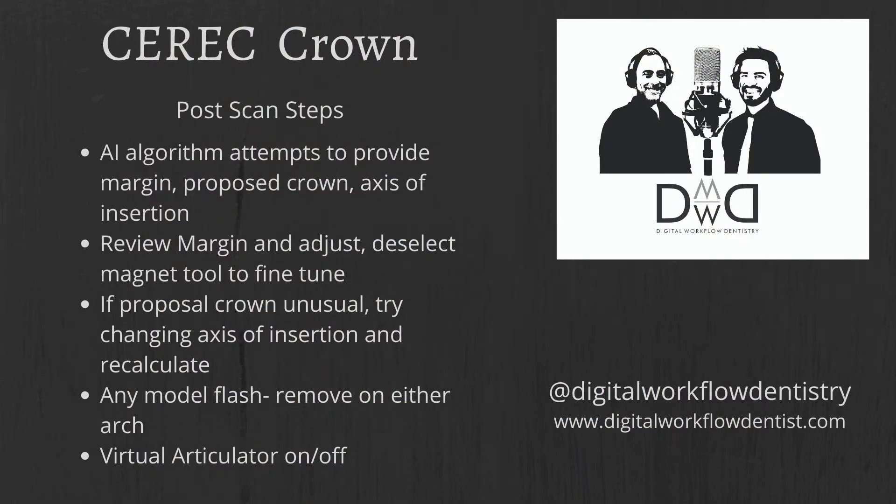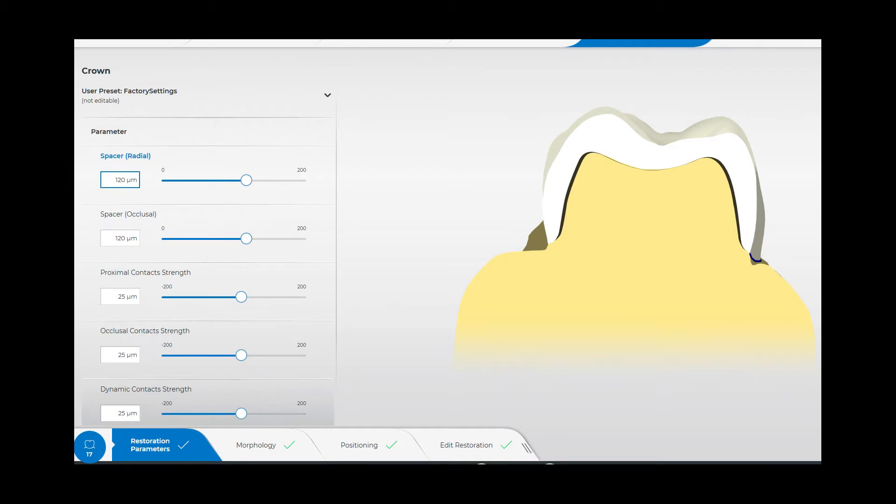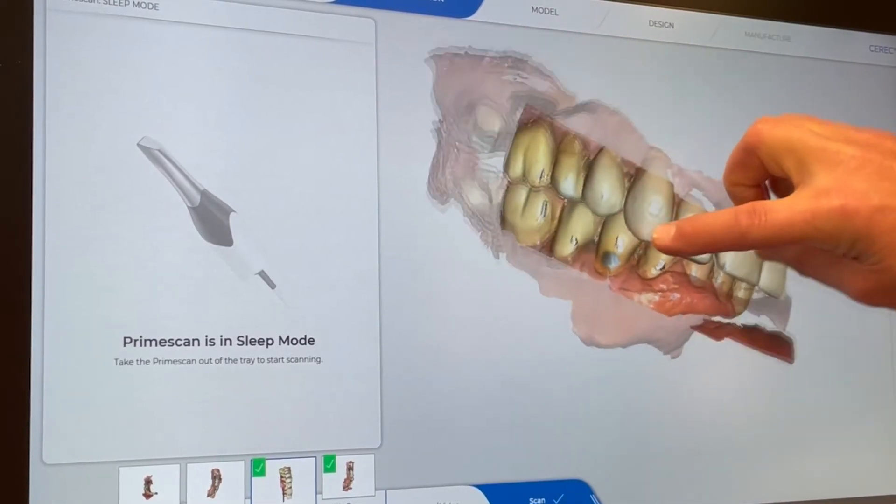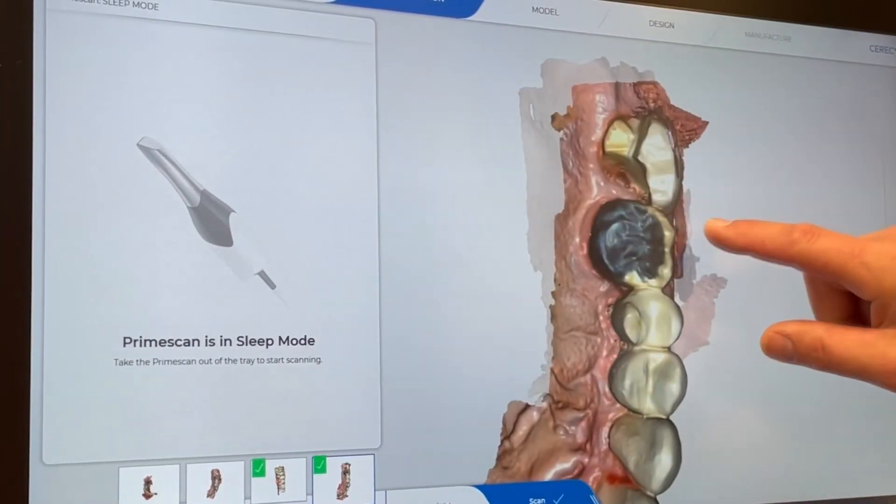Now let's talk about some of the post-scan steps. The AI algorithm attempts to provide a margin, proposed crown, and axis of insertion. Review the margin and adjust. Deselect the magnet tool to fine-tune, and if the proposed crown is unusual, try changing the axis of insertion and recalculate. It's also important to remove any model flash. Here are some of the parameters that we use.